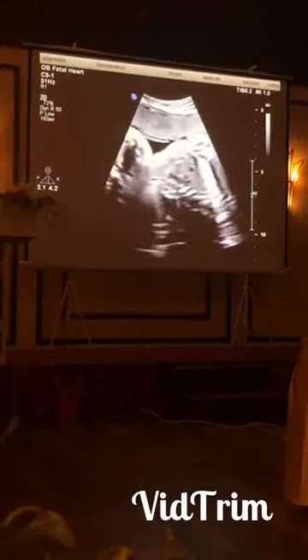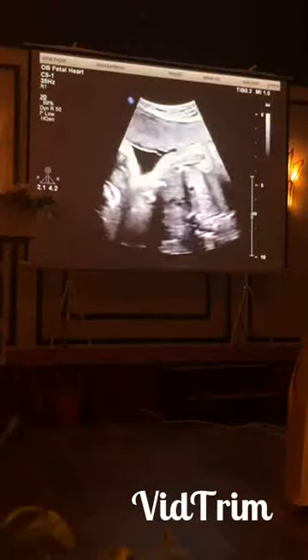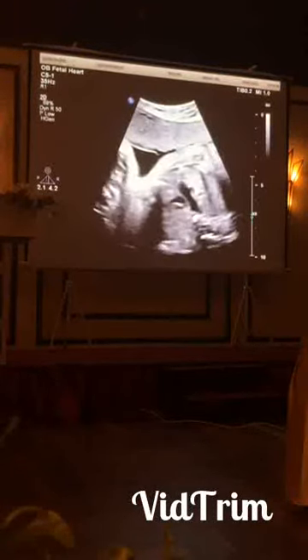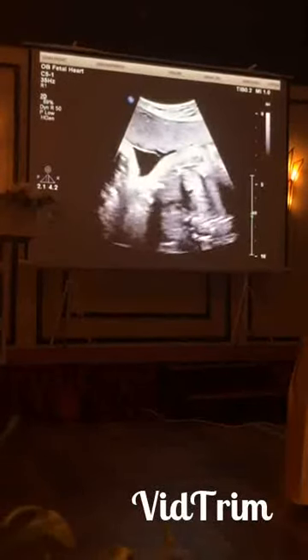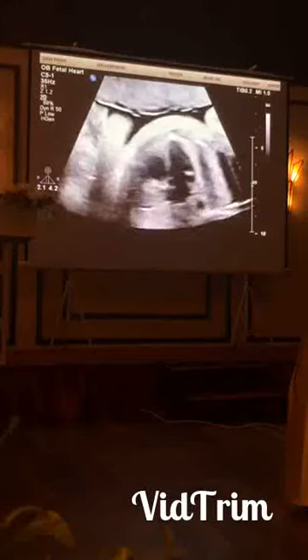It goes closer to the spine up. So I think it's just the brachiocephalic trunk that is bigger than the rest. But then what do you think about the arch here? Look. Is it a bit smaller than usual? Of course you can measure it, but you can see that it looks smaller, and you have diastolic flow, I think.